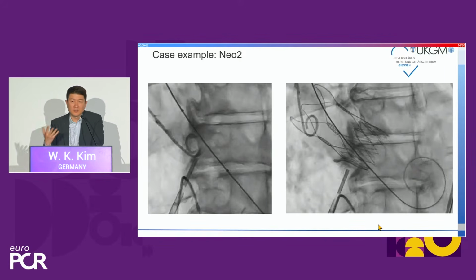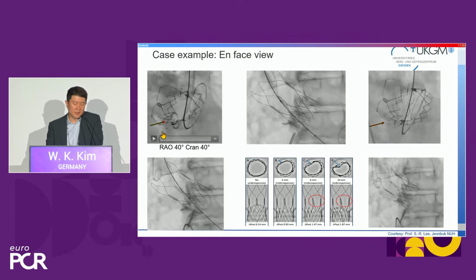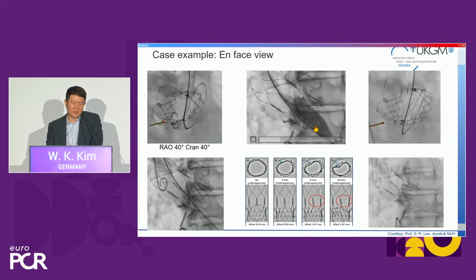And I suggested doing a post-dilatation, but the operator was hesitant because of the shallow position. And I suggested going to an en face view. And here you can see what it looked like, and you can see that there is really some indentation in this region. And this was the major driver to perform post-dilatation that you can see here.